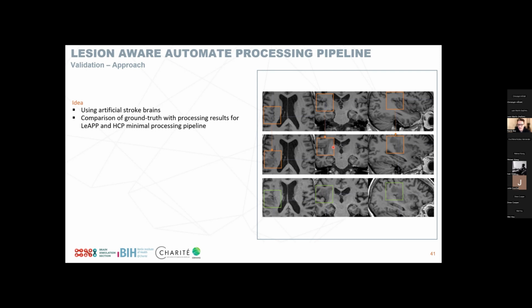So we have a fairly complex algorithm for actually embedding this data, but if we're thinking about, for example, a very small brain volume-wise, and the lesion is taken from a patient with a very large skull and a very large brain, the simple size differences can end up with lesions going all the way into ventricles or into the skull, etc., which of course is not realistic because we don't have a lesion in the actual skull.